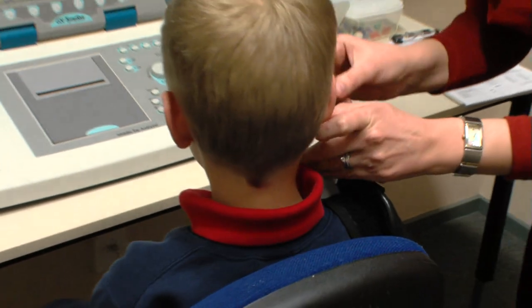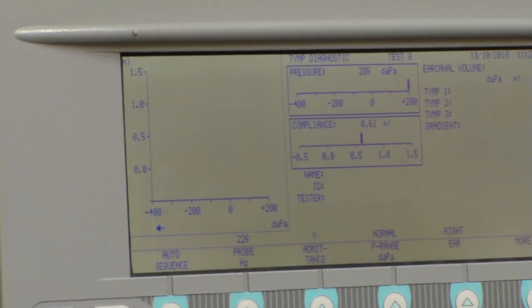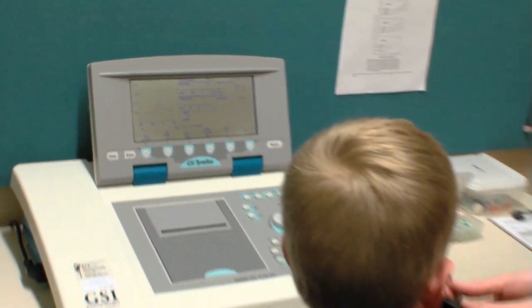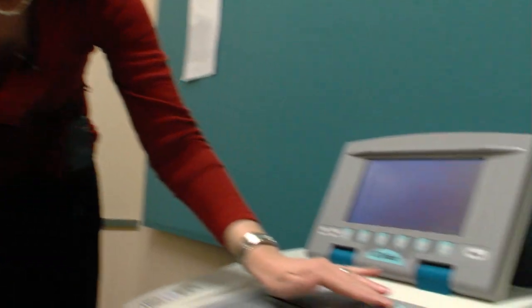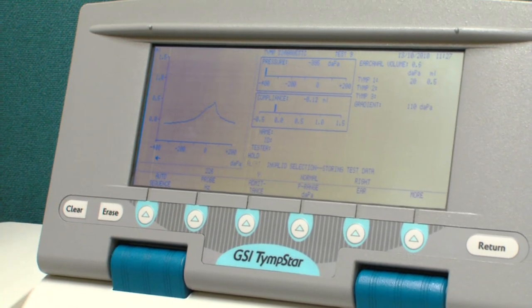All right, you watch the screen for me. I'm going to pop this wee tube in your ear. There we go. Watch over there. There we go. We got a wee mountain that your ear drew. Right, let's quickly see what's happening on the other ear. Yeah, we're going to do the other ear. Oh, let's see what this one tells us. Let's have a look. Right, ready, let's watch there. Nice and still like a statue. Look at that, another beautiful mountain. That tells us that ear's working nicely, your eardrum's moving. You don't have any infection, it's gotten better.